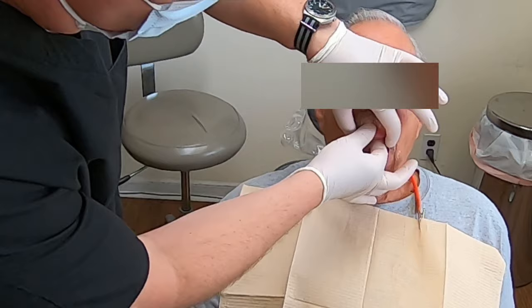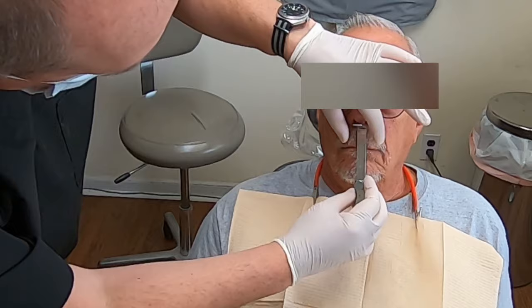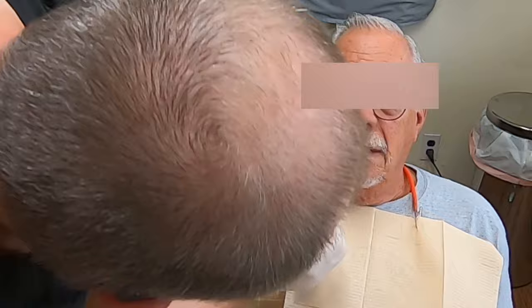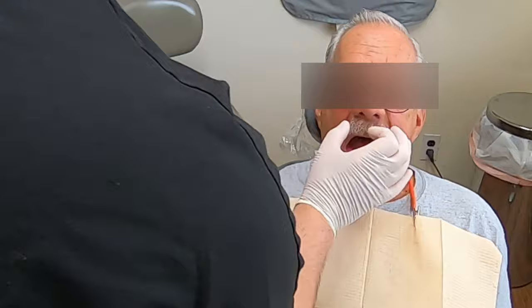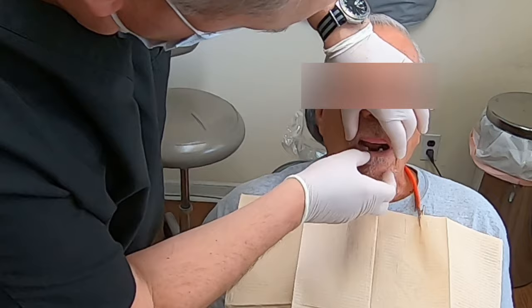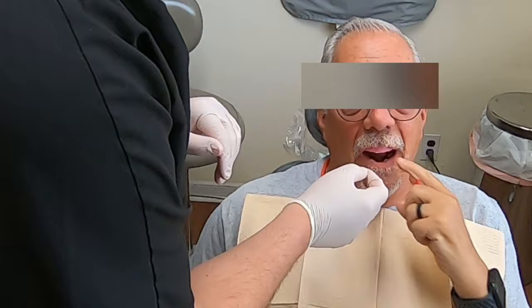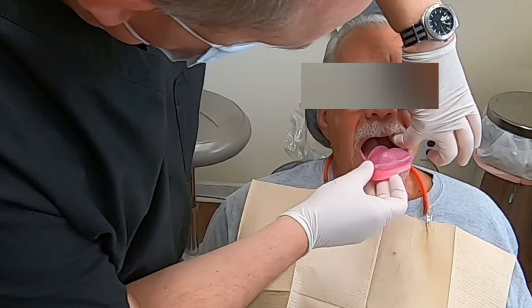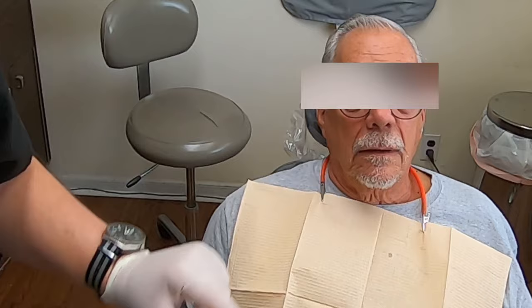Ideally, I want to see a little bit of wax showing when the patient's lip is at rest, but it's going to vary from person to person. I'm checking to see how full their lip is and where that wax is. I took a little too much off the patient's left side, so I'm going to add a little bit back. I'm also removing a little off the bottom and checking again. The patient was feeling a little more pressure on the left side, so I removed some and we tried again — now he's telling me it feels comfortable and more normal. We're spot on.